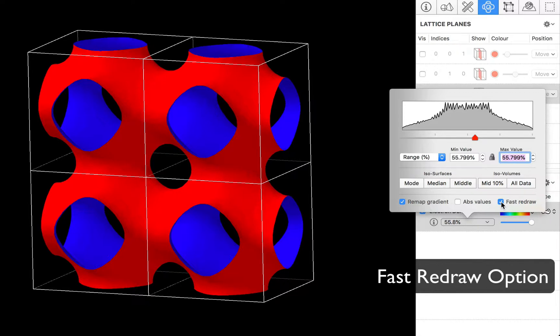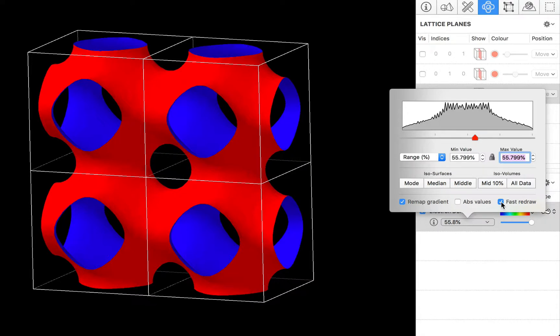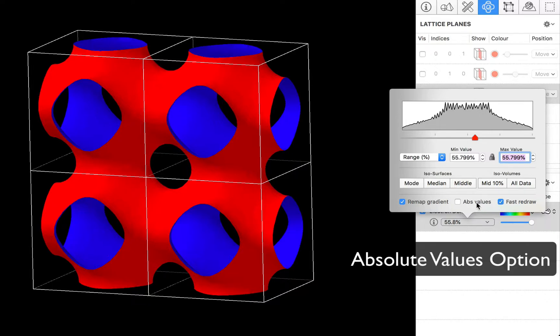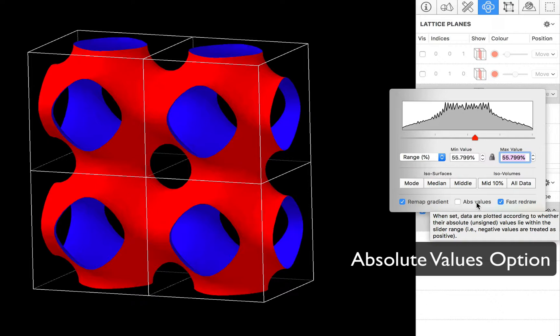That takes a bit of time so with the fast redraw the program will use lower resolution whilst you are adjusting the slider values. And when the system is idle it will revert to the full high resolution display. The other option that you have which isn't relevant here but you have the option of just plotting absolute values. So that if you have negative values they will be plotted as if they were positive.